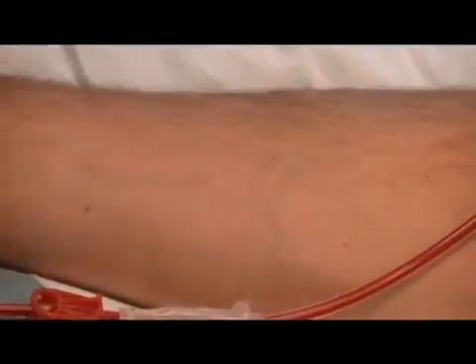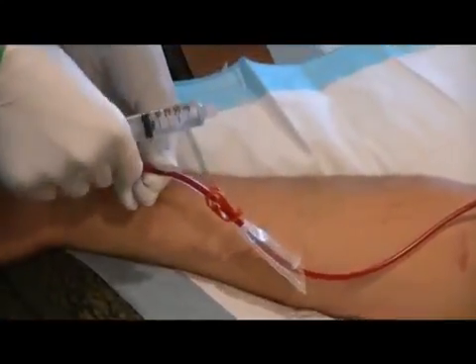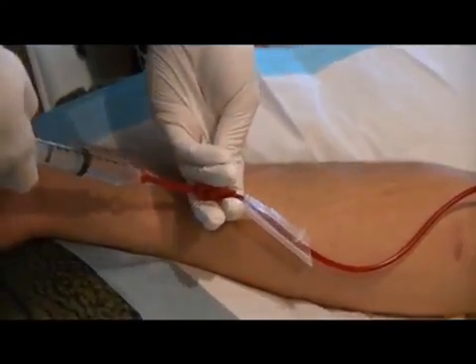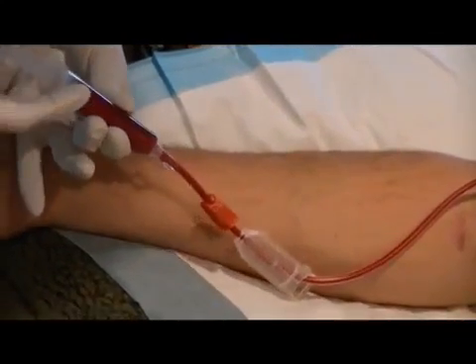Then this is when we use the saline to flush and make sure that we've got good return if the needles need readjusted or anything. So you always pull first so that you're not shooting it in if it's not in the right area. And it pulls good.